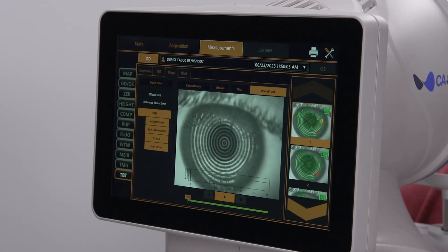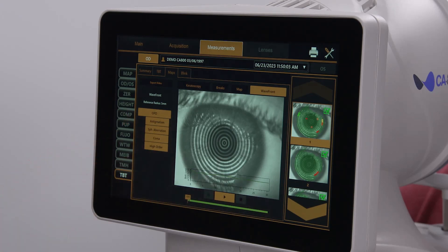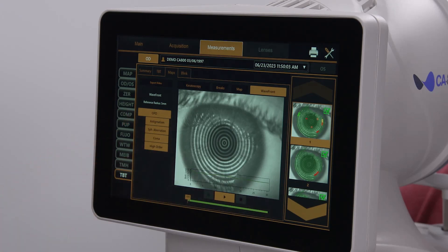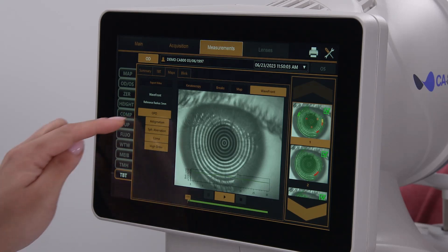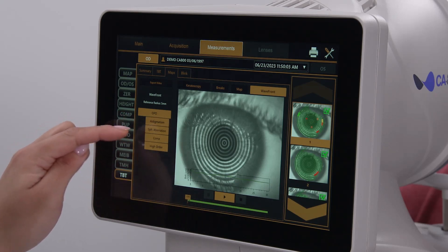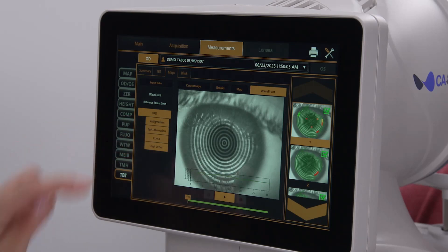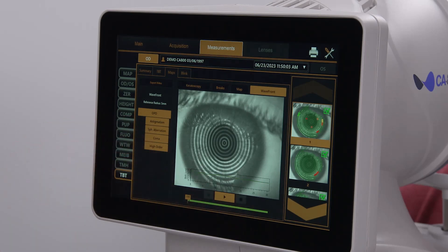You can choose to look at the whole optical path difference, or OPD, which is the total wavefront and aberration from the anterior cornea and tear film, or select from astigmatism, spherical aberration, coma, and other high-order aberrations.